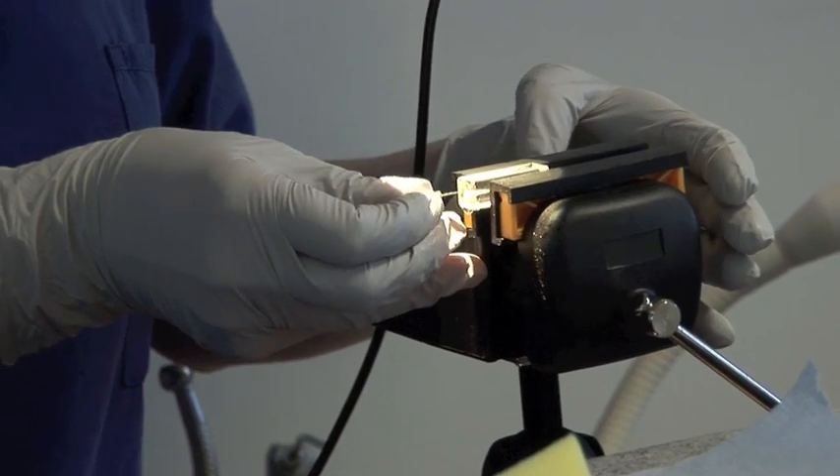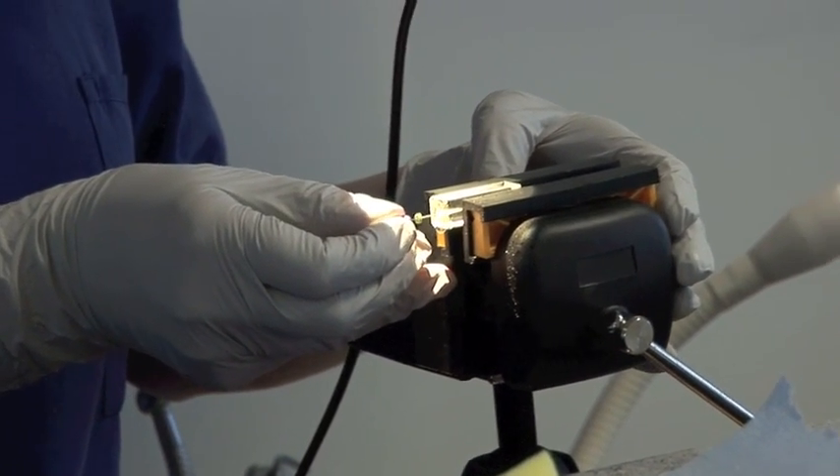Place some more irrigant into the canal. I'm now going to use a size 10 K-flex file and see whether I can negotiate further down. We have an estimated length — at this stage on a patient you would be using an apex locator, and the apex locator would confirm when the file is just coming through the apical foramen. On this block this is at 17 millimetres — I'll just check.